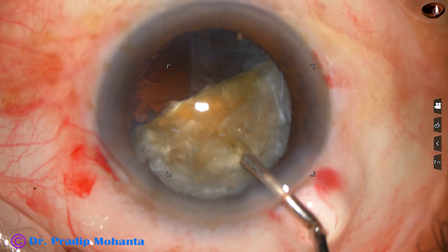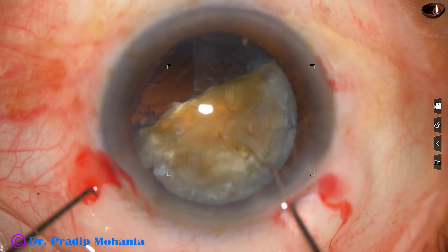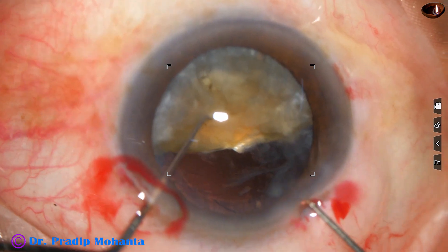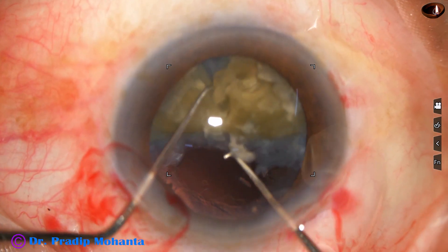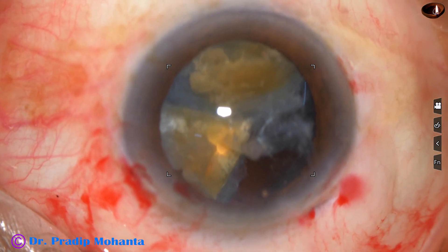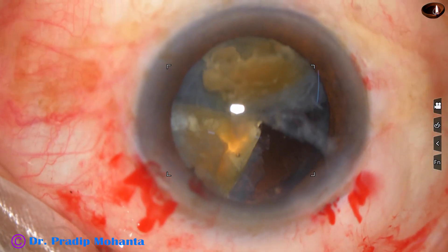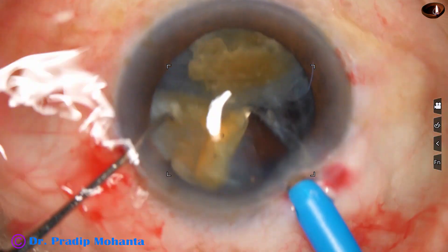I find it difficult to rotate this heminucleus because the two fragments are not free. So we inject some HPMC and take two hooks. This is a Sinskey hook, and the other is a modified Sinskey hook known as the Mohanta chopper. It goes behind and the bond between the two fragments is torn. Now one piece's apex projects into the anterior chamber and it is safe to emulsify that piece, while the other piece below protects the posterior capsule.